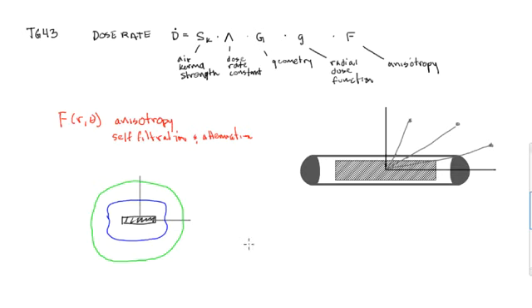Okay, now there's another problem here, which is that sources in an actual implant come in at all kinds of different random angles, let's say. And it's often very hard to tell what angle the source is at from radiographic imaging and so on. So if I'm looking out here at some point, I would be observing these sources each at a different angle to the source. So the anisotropy factor would be different for each of these four sources here.